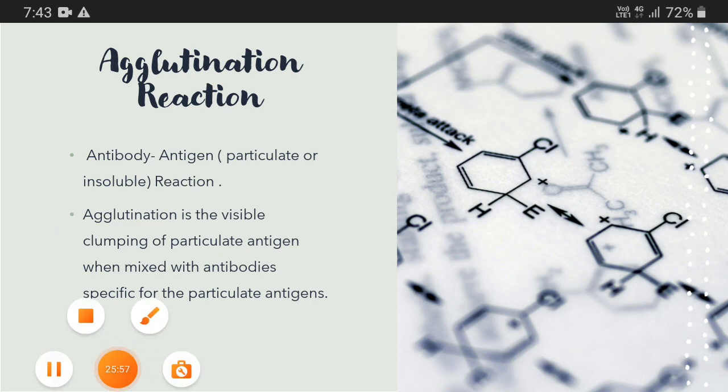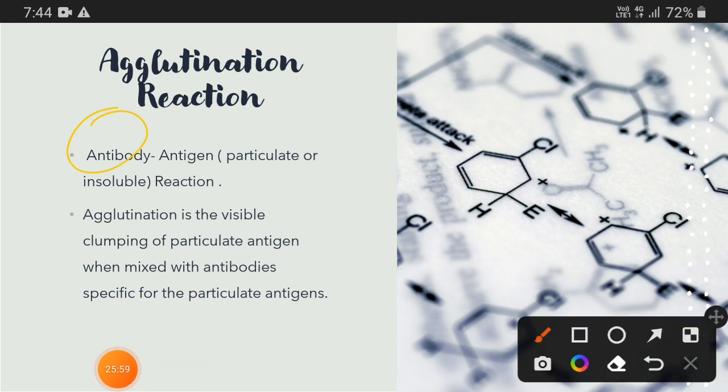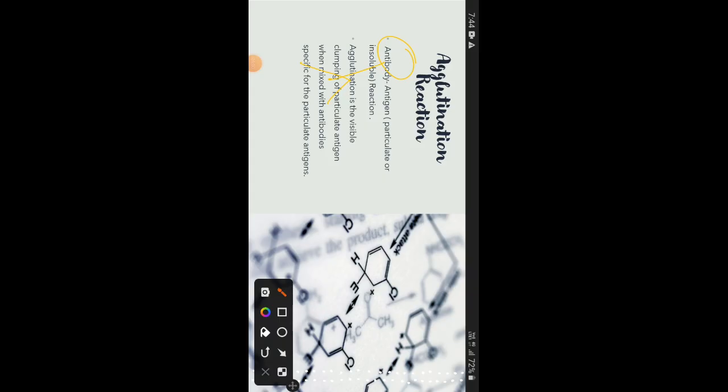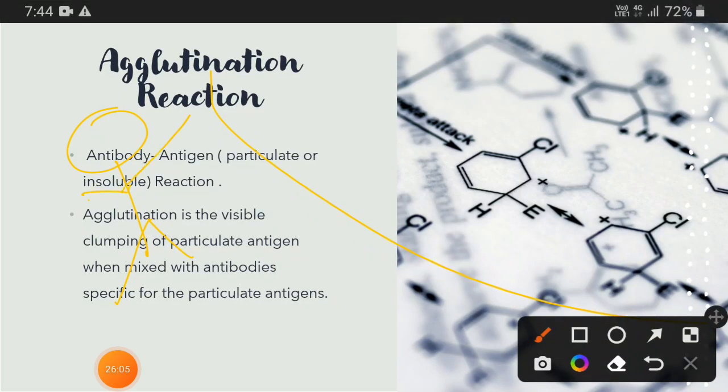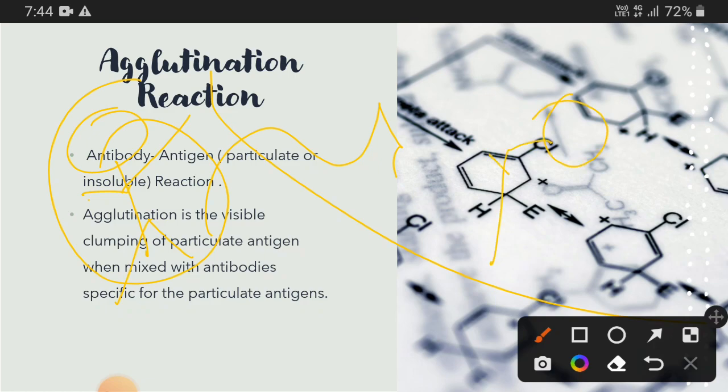This Coombs test is based on two facts. Here we use the principle that when human antibody is injected into a rabbit, the human antibody becomes immunogenic, and as a result the rabbit's immune system will produce an antibody specific for that human antibody.